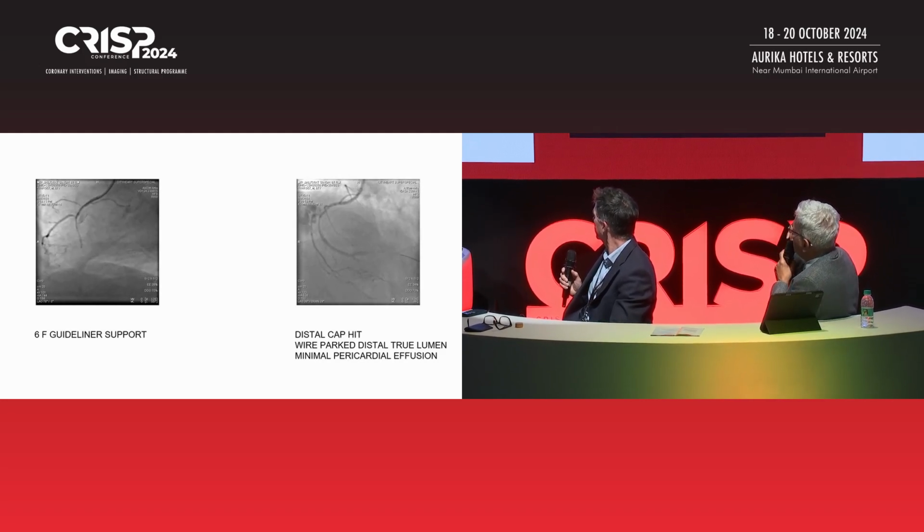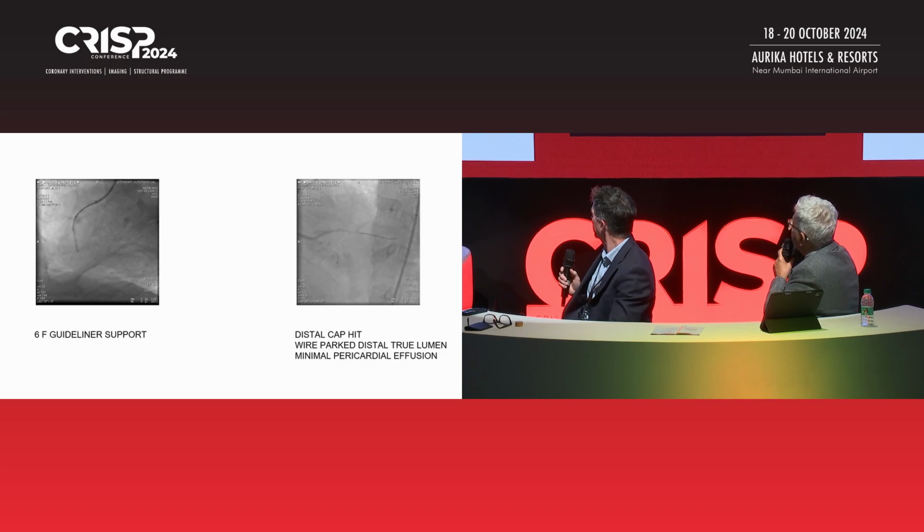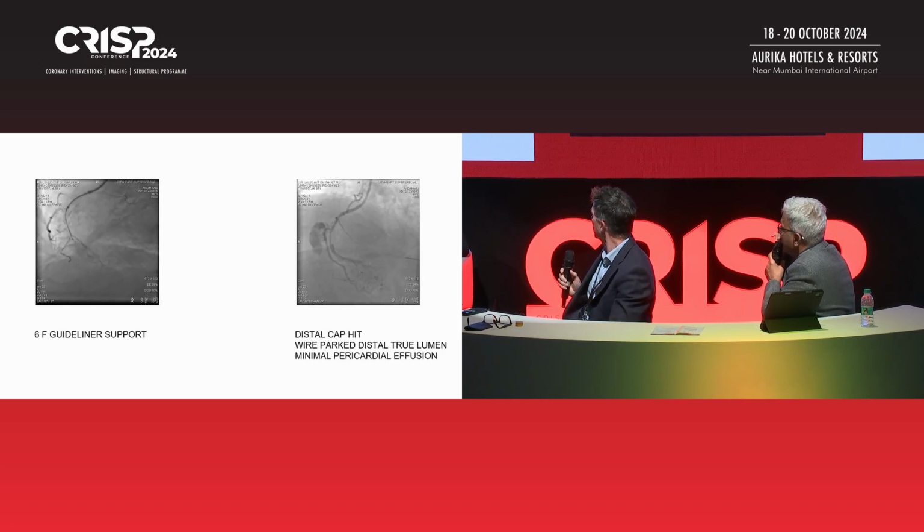But for her, you can see that it has continued to ooze, only it has not gone into the pericardial space at this time, because the contrast which is seen external to the vessel has definitely become scary, and it is quite horrific actually. Such large hematomas are a cause of dry tamponade, and they are very difficult to manage, frankly speaking. And when we open up the RCA in this situation, the retrograde collaterals may increase the leak even more. It's better to quit at that time, it is the best strategy.